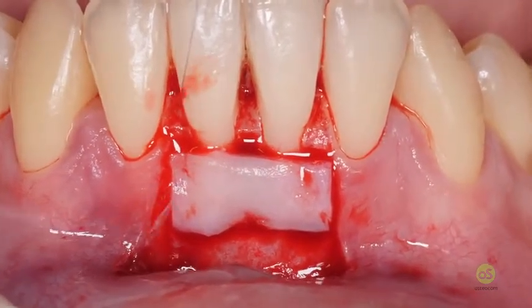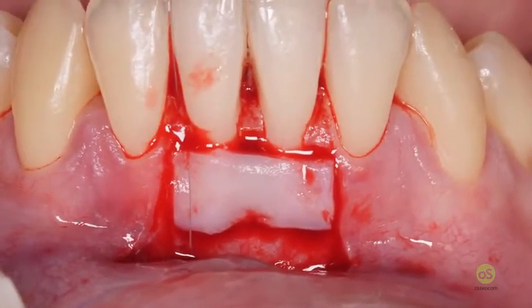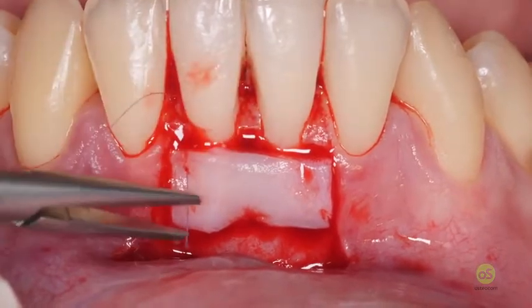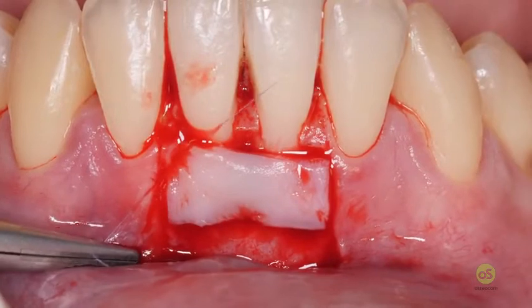Every single surgical knot should be placed on the graft in order to be compressive and not at the level of the papilla.